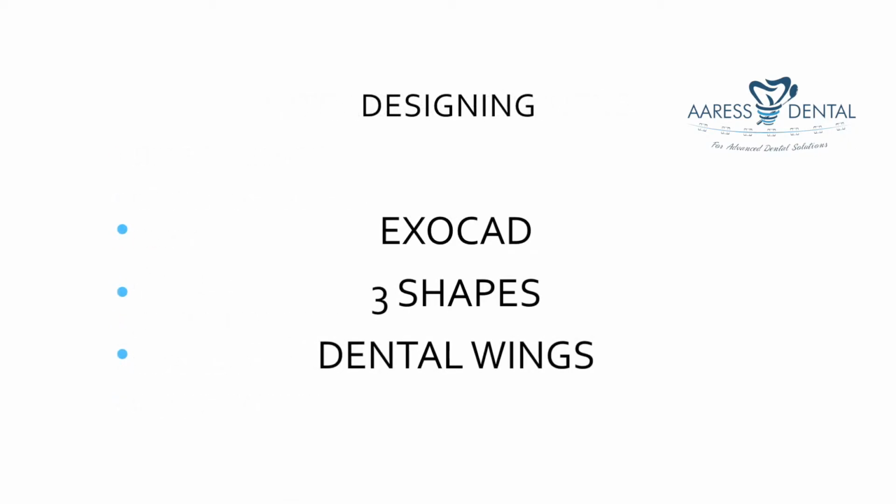Once we acquire the data with the scanner, next we have to design the processes. The most popular designing software is Exocad, followed by 3Shape and Dental Wings.